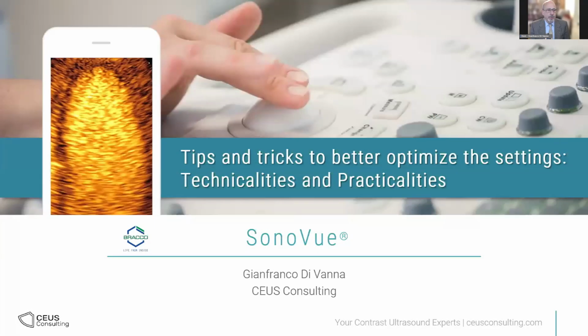So I'm going to show you a collection of common tips that I have accumulated during my visits to customers and during the OEM trainings. These are recommendations that you can follow to improve your contrast examinations. And it's not only for beginners, but also for whoever has experience with contrast.